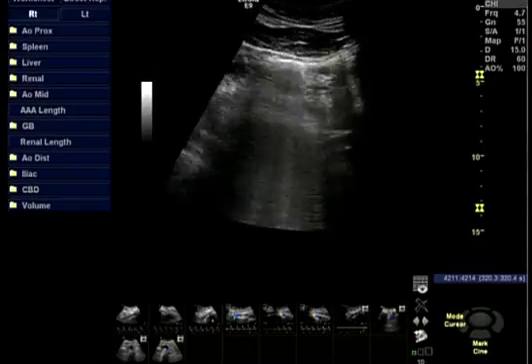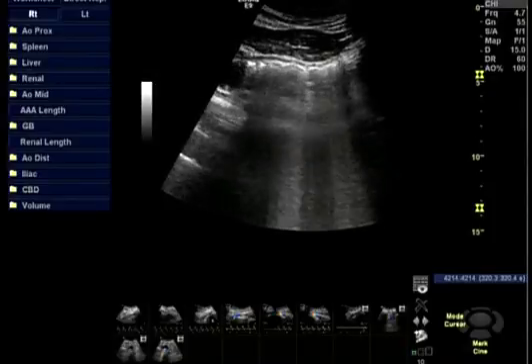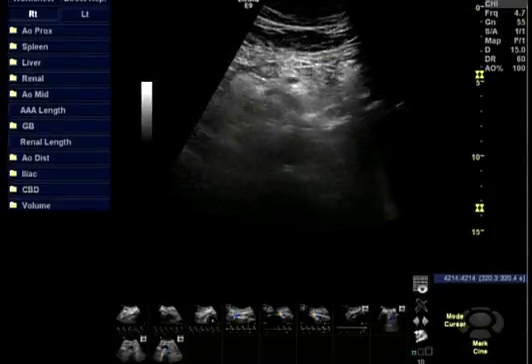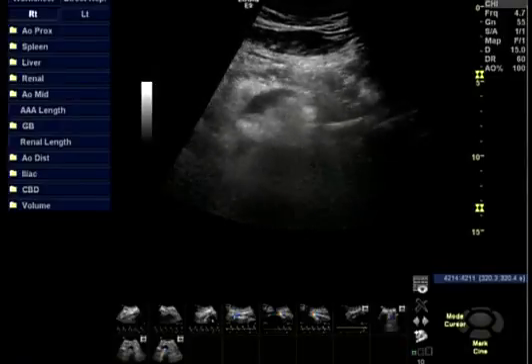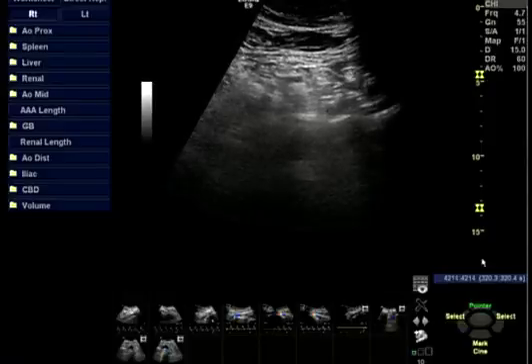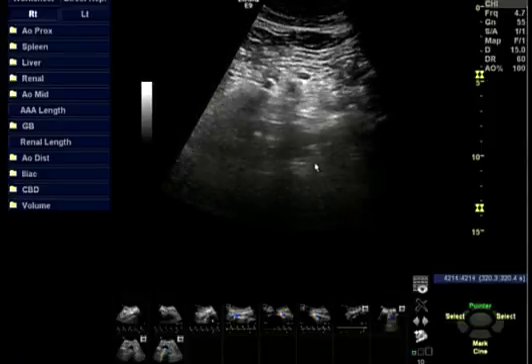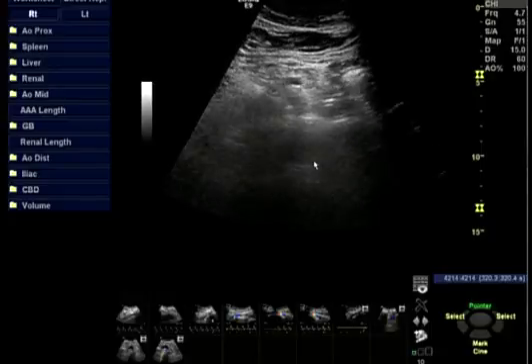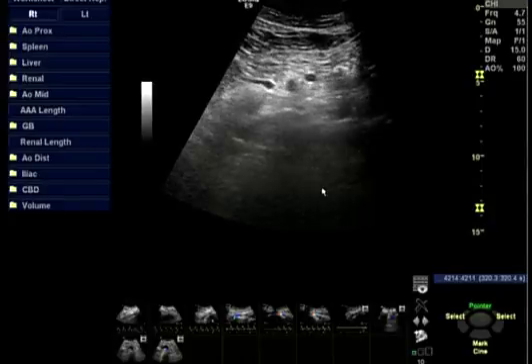So in this particular case, we see on the image I'm just below the level of the diaphragm. See some small gas bubbles, which are typical in these patients. Hopefully they will not be in the way during the entire examination. I'm getting a brief glimpse here. Get my arrow on there so you can see it, of the abdominal aorta, the proximal segment of the aorta. We'll show this in color Doppler in just a few seconds so you can see it more clearly.